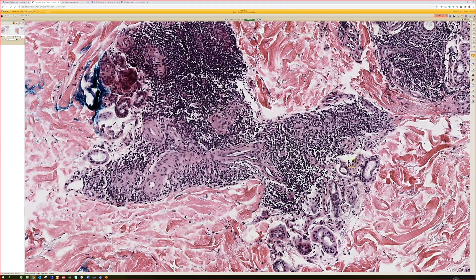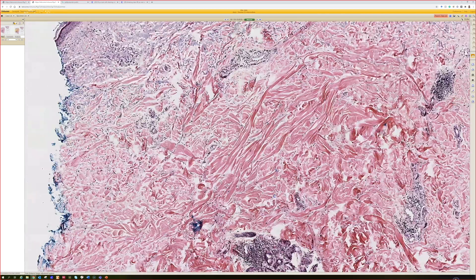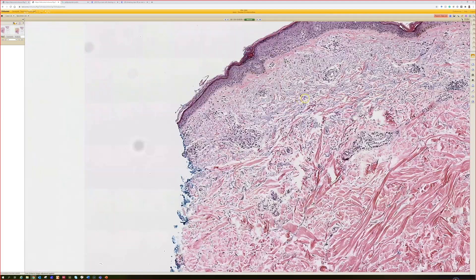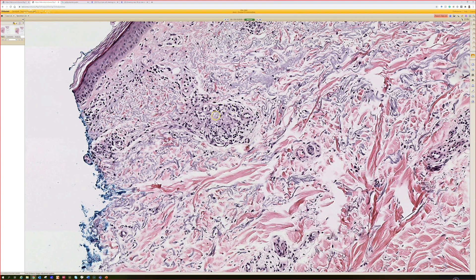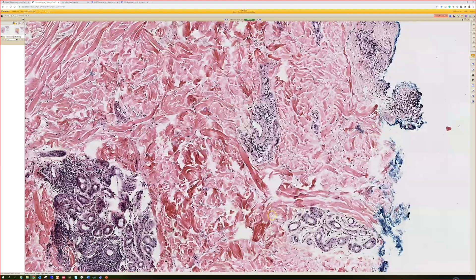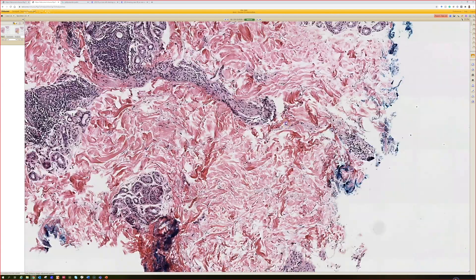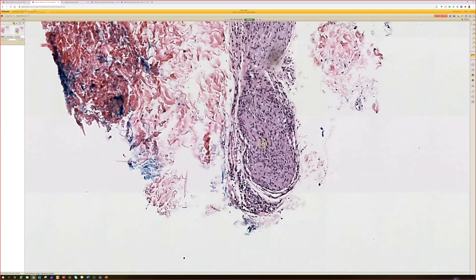There might be a little tiny granuloma here, but it's subtle. Up here there's very little, except right over here there's one granuloma around a vessel. A perivascular granuloma is basically a perineural granuloma until proven otherwise — in leprosy we tend to get granulomas around nerves, and nerves and vessels even at the small level track alongside one another. So anytime I see granulomas near a vessel, I suspect there may be a nerve nearby, even if I can't visualize it.